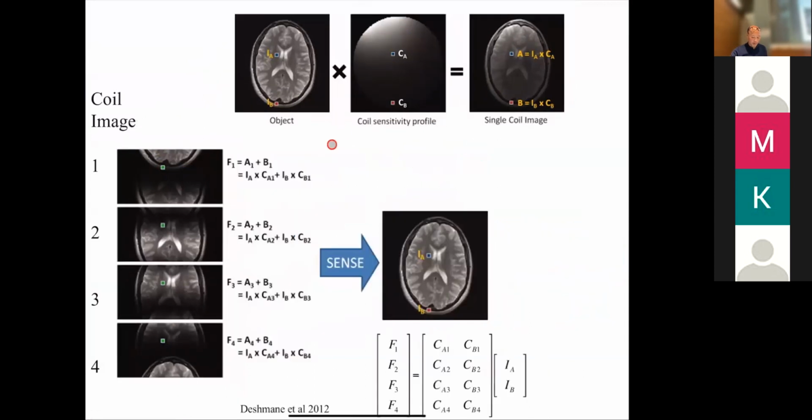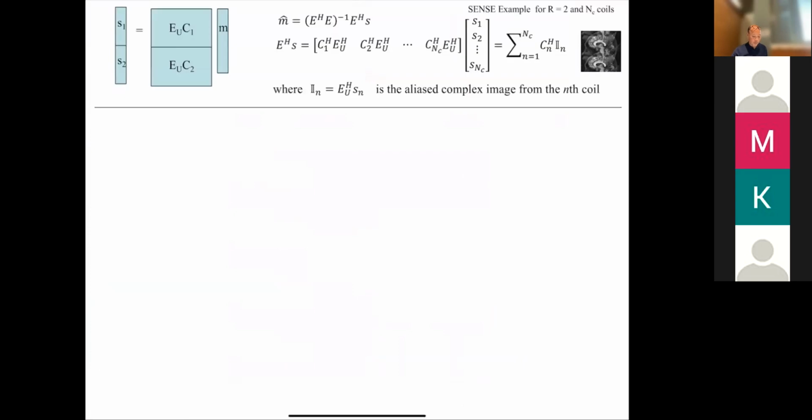So essentially, this is just doing this in nicer form. Okay, but we get the same solution. Right. Okay, so this slide I'm just going to zoom through. Basically, it's just showing that if you want to solve this equation, like for two coils, you can break it into this. It's still the least squares estimate.